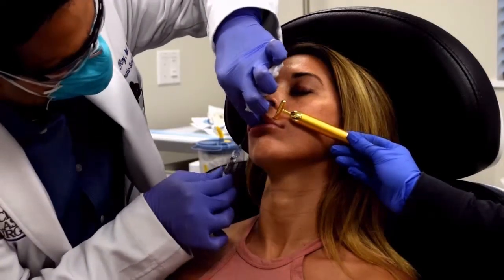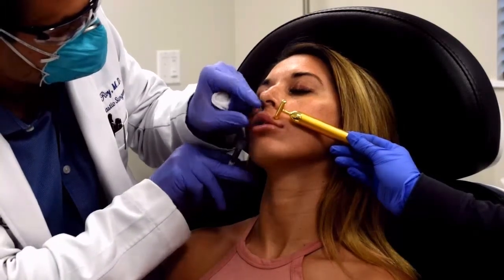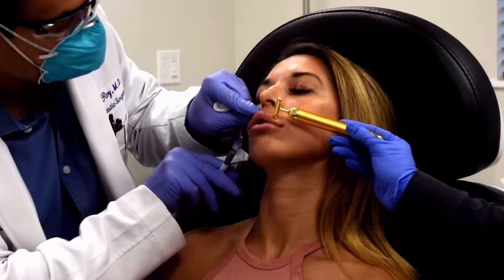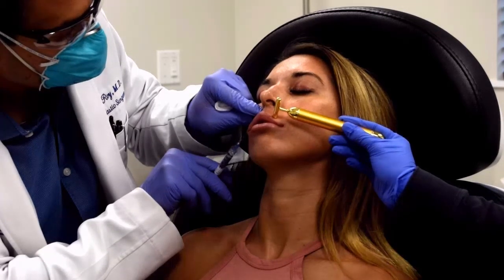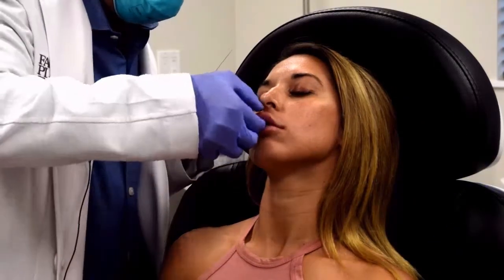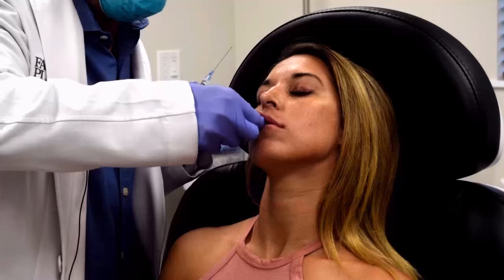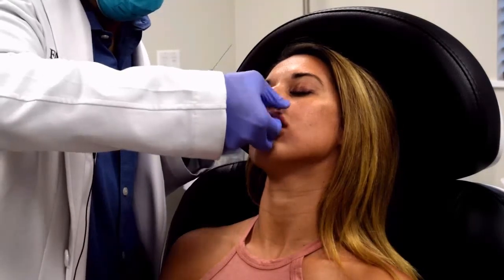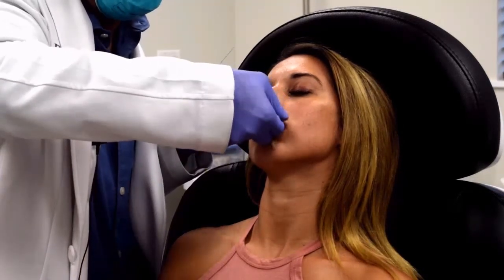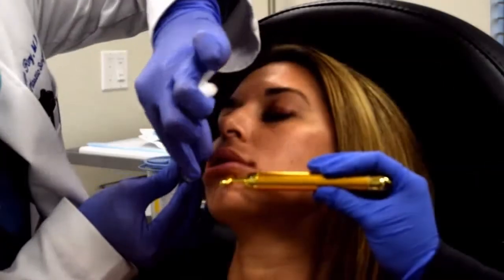I also really like the smooth, linear deposition of filler in the lip. I think it just results in a very natural lip contour, and you can see it just takes a few seconds per side. I usually do somewhere around 0.25 cc's of filler per quadrant, and that's really a full one cc in the lip.